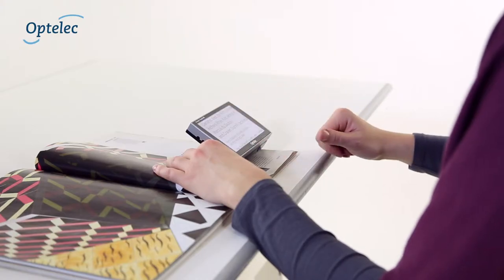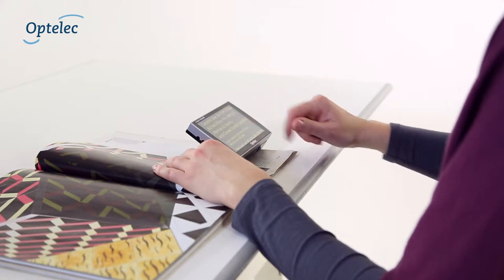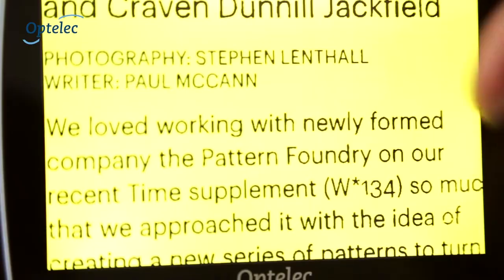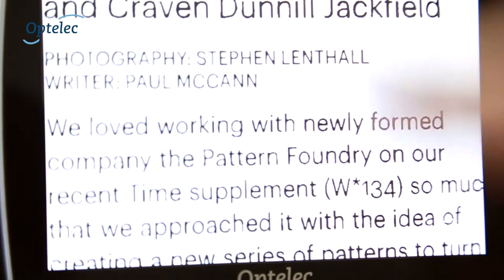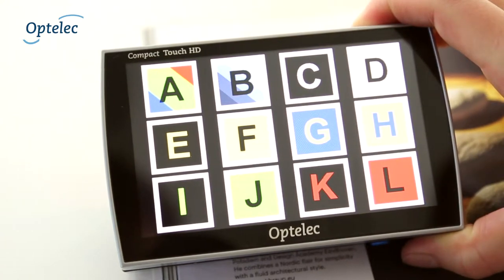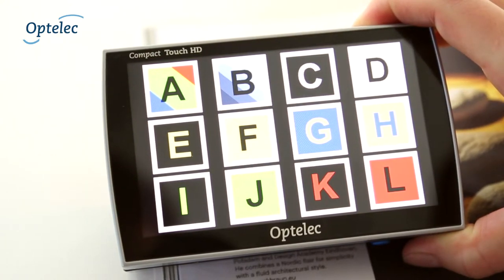To set the viewing mode, simply slide one finger from the top to the bottom of the screen, or in the opposite direction. You can cycle through multiple high-contrast color modes and select the mode you prefer with ease on your intuitive touchscreen display.